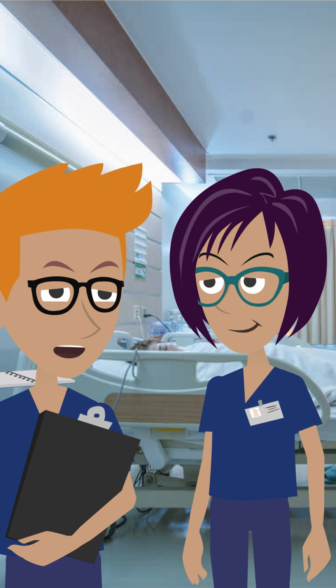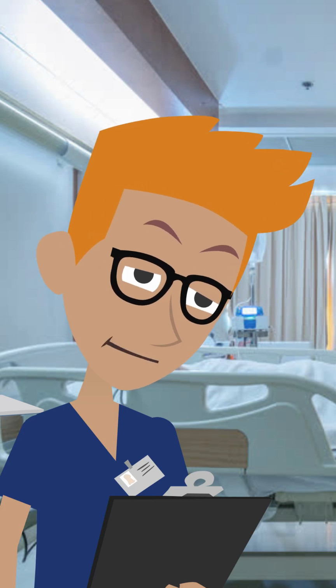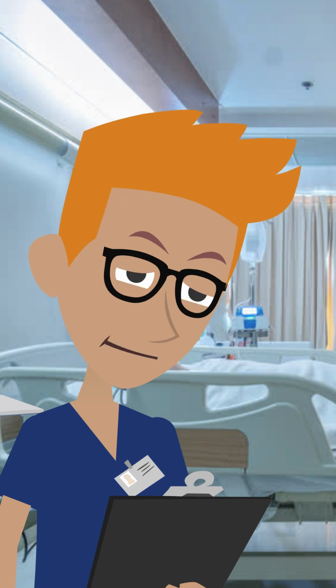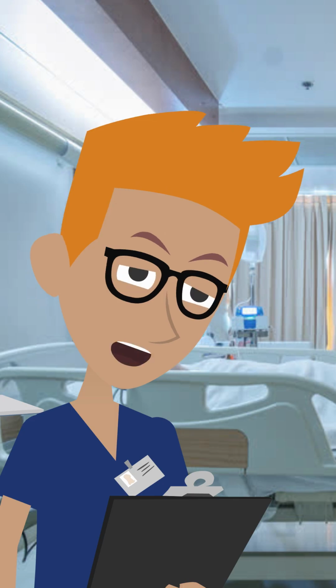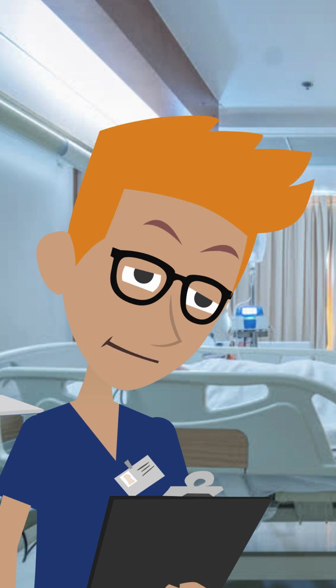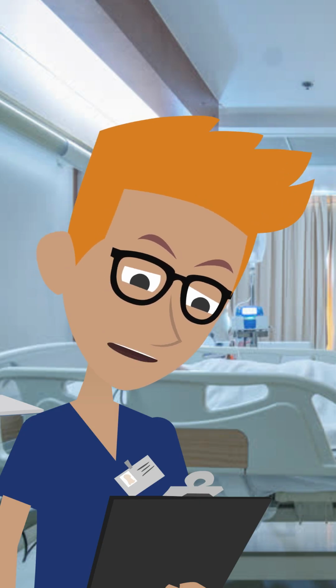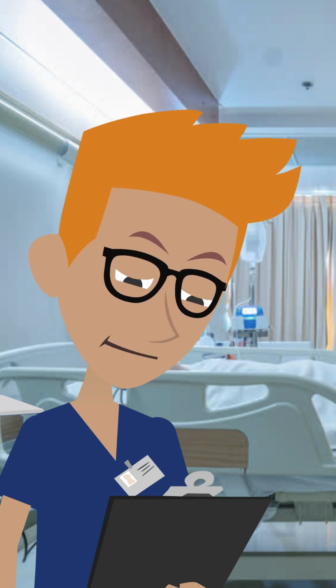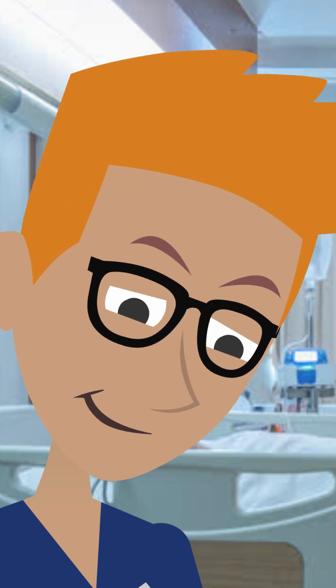Hi Susan, are you ready to receive Mr. Aziz now? Sure. Mr. Aziz had an intercostal catheter inserted this morning after a spontaneous pneumothorax. The procedure went well and Mr. Aziz is resting comfortably now after taking some pain medication an hour ago. He's been prescribed regular pain medication on his medication record. Okay. I'll check his pain level when I do his observations in an hour.